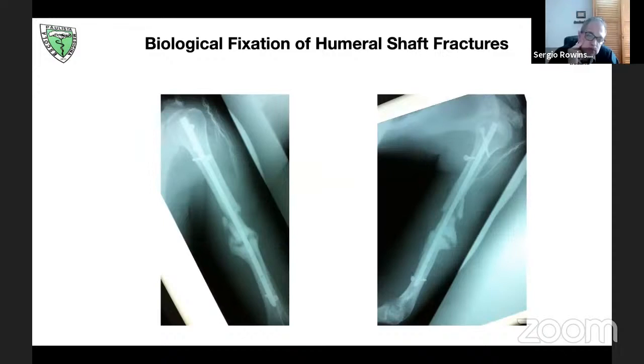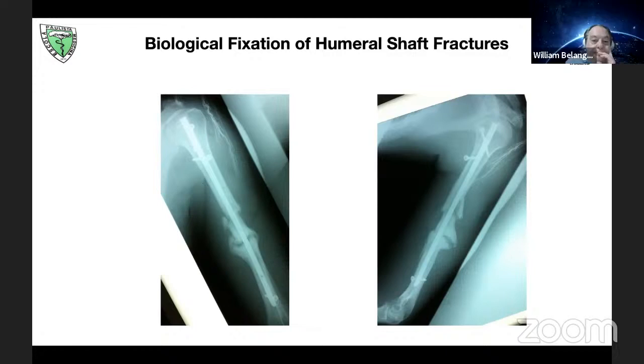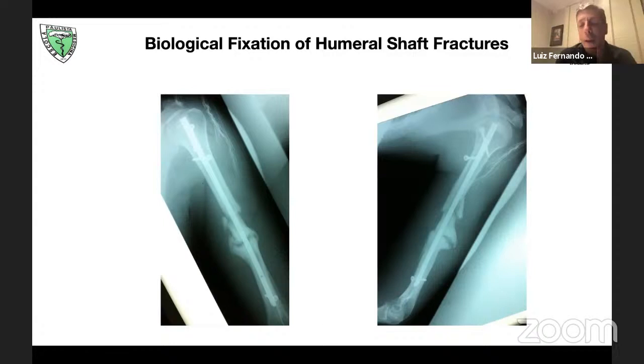So this is the immediate post-operative X-ray. At that time we used just one screw on the distal aspect. Nowadays, like Dr. Shiva said, I use 2 screws on the distal aspect of the humerus. So who of you wants to bet: fail, or works?